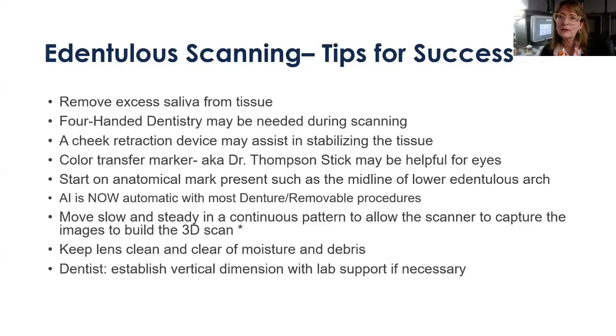Really important to keep the lens of the camera clean, right? With iTero, you want to touch the tissue, but you don't want to smear debris over the lens. So again, keep those 2x2s handy. Even sometimes a pre-moistened alcohol wipe can be very helpful as well.